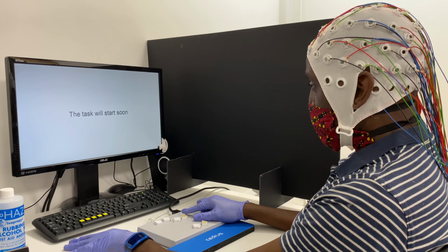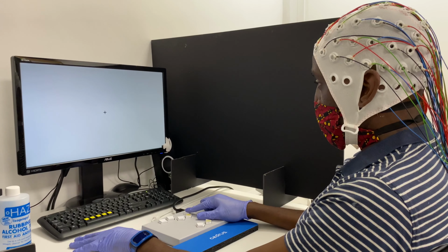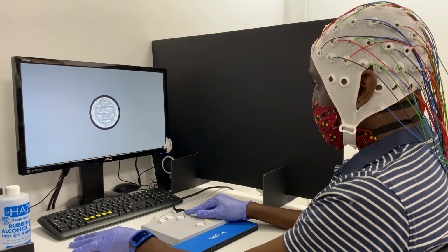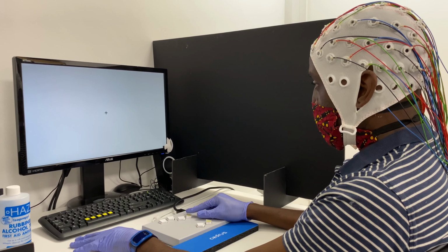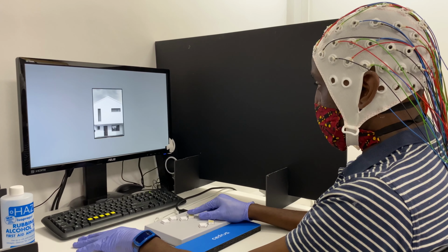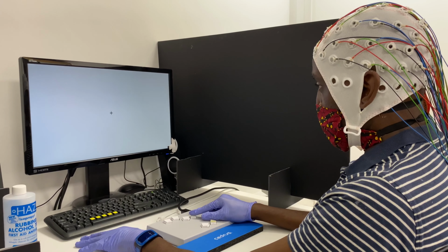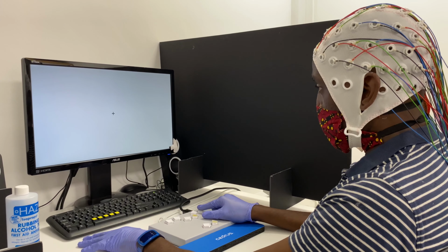Now we are starting with our experiment, and we already know how to perform the task. It's a learning experiment. He is seeing different houses and he has to find out if a house belongs to a group A or group B. For that he has two different buttons. One is labeled with A and the other one with B. Every time he assigns a house to a group, he will get feedback. When he's correct, he will see a £1 coin, and if he's not correct, he will see a no cash coin.